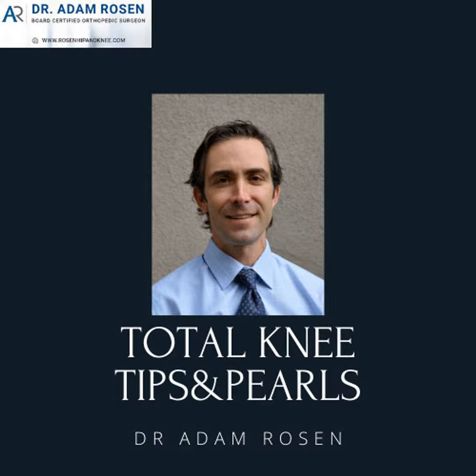So for my tibia, what I typically do is I'll start again with a flexible osteotome. And it's important to understand, do you have spikes? Is it cemented? Is it press fit? Is there a keel? Where is the keel? Where can you get access to the tibia? So you need to understand the geometry of the tibial base plate, but I'll start across the front, typically going up to the fin or the peg or the post that I have on the tibia, and I work my way as far laterally as I can across the front.